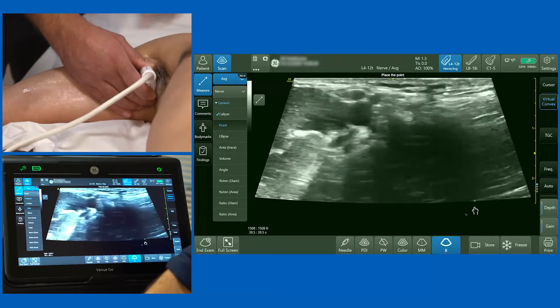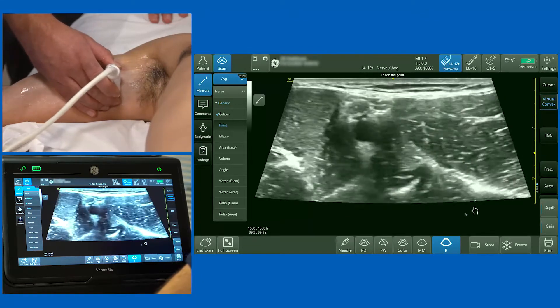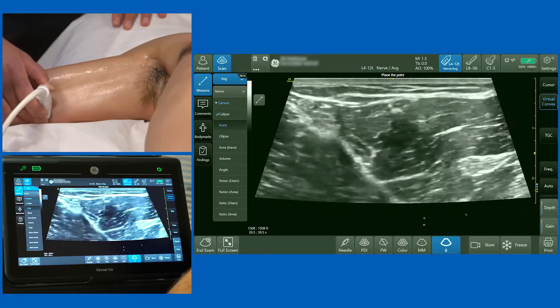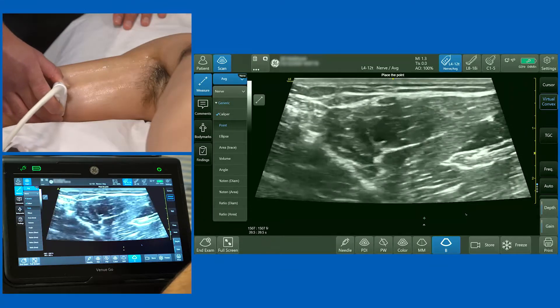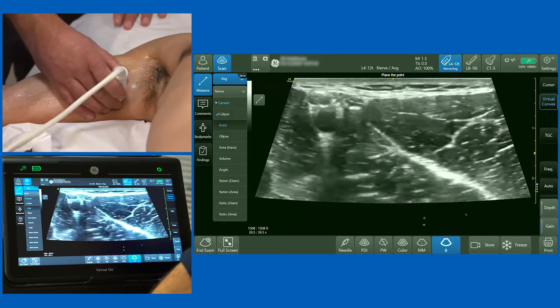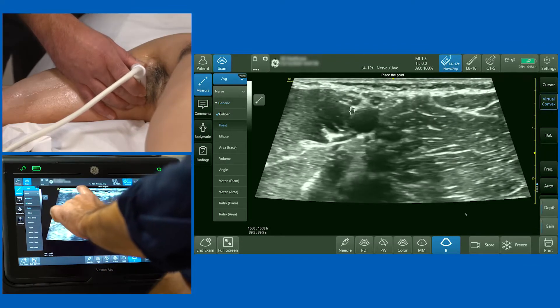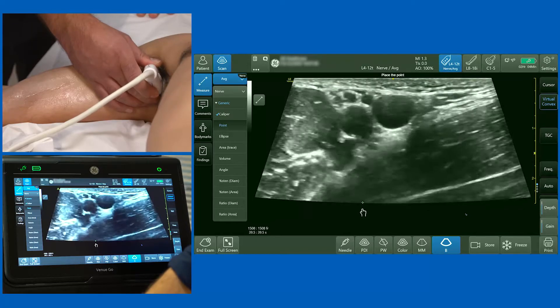Scanning down the arm towards the ulnar groove, the ulnar nerve shoots off to the right-hand side of the screen. It appears as a circular honeycomb-like structure right underneath the fascia. As we scan further down towards the ulnar groove, it dives into the ulnar groove. Scanning back up, the ulnar nerve comes up to meet the median nerve, giving the classic Mickey Mouse sign with both the median and ulnar nerve ears and the axillary artery.